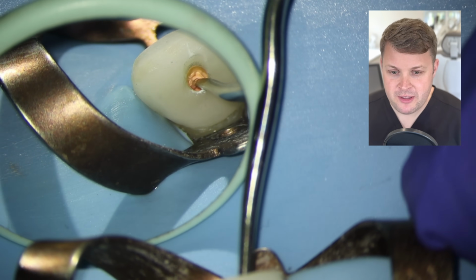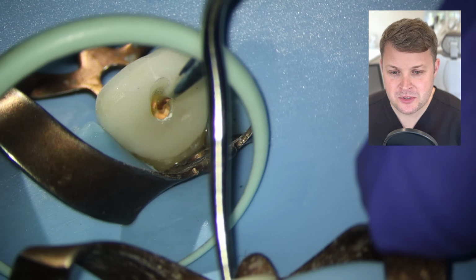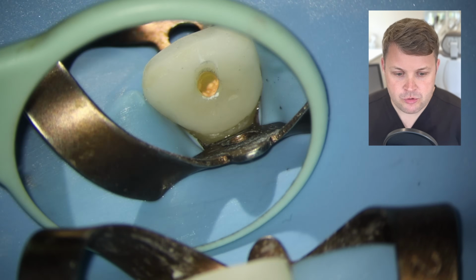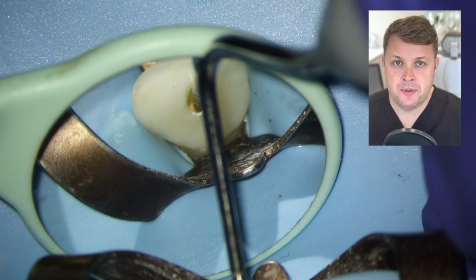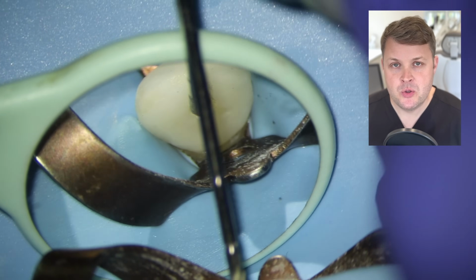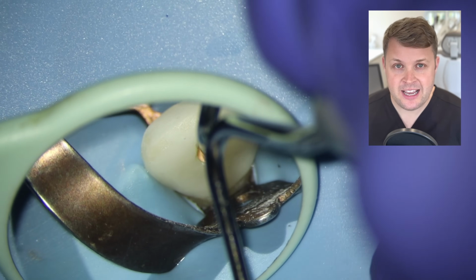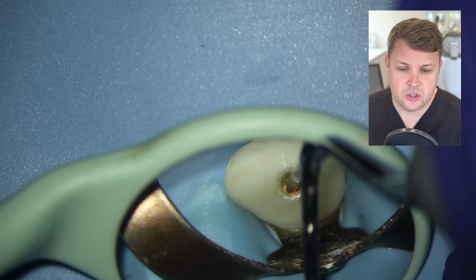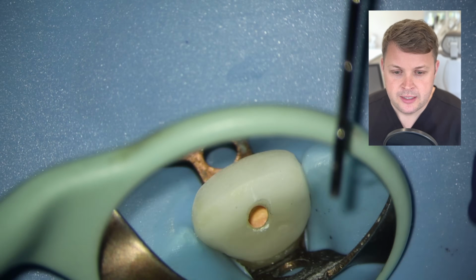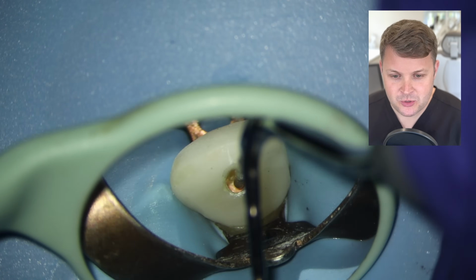We're going to, again, remove the excess. We want to make sure that we're not pushing out or pulling out the whole GP cones. And what's really, really important in these types of cases is that you're getting the GP below the CJ, because what you don't want to do is leave GP in the coronal tooth tissue, because it can stain the tooth. And this patient's got some nice crowns and things. So you'll notice here that we've condensed it all down, we've given it a bit of a clean up, and it's all nicely finished.